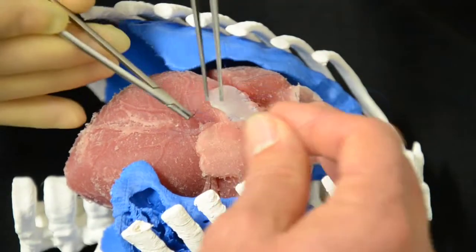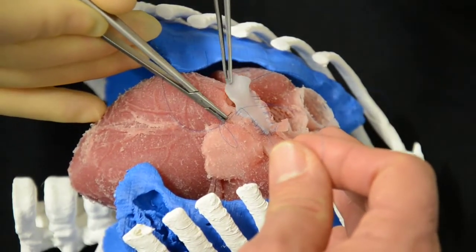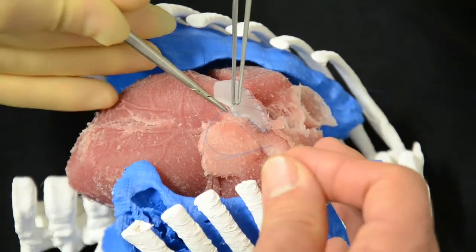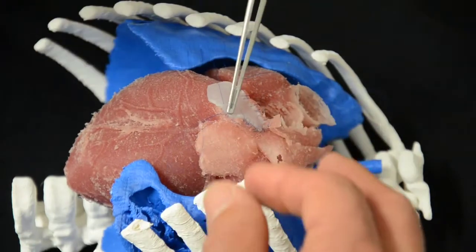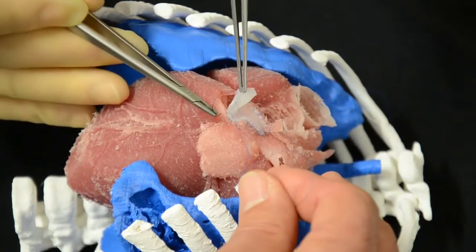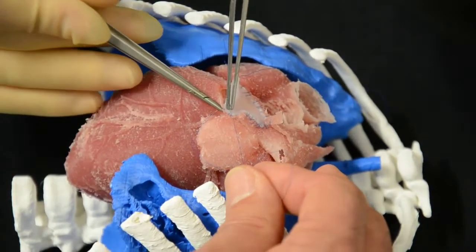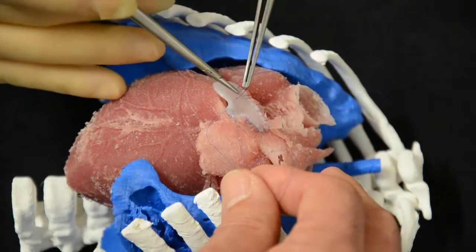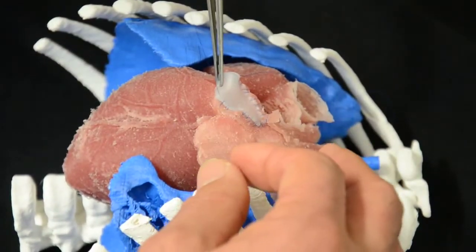What would be the normal thickness of the patch that you would use? That would probably be half the thickness of that one, if not more than that. But more importantly, when he's going through the artery — or what's supposed to be the artery — it's so flexible that it is similar.